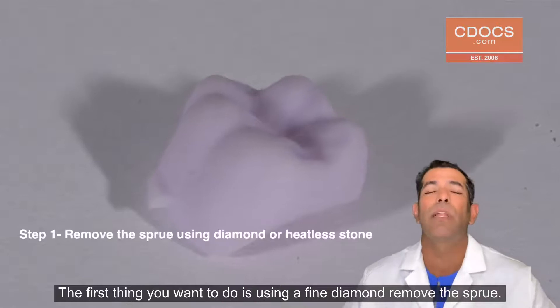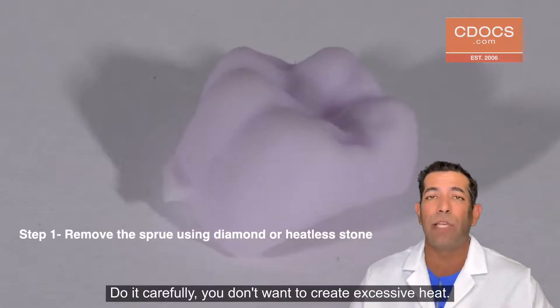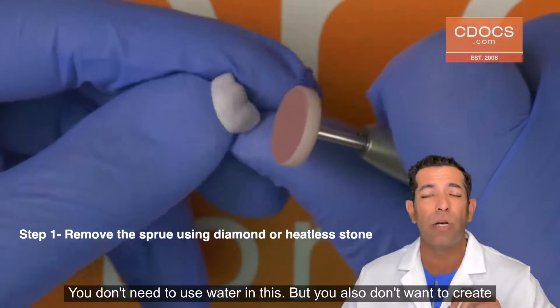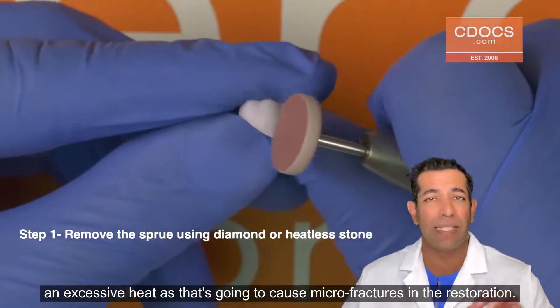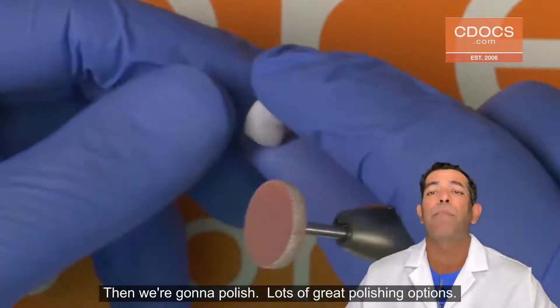So how do we do this? The first thing you want to do is using a fine diamond, remove the sprue. Do it carefully — you don't want to create excessive heat. You don't need to use water in this, but you also don't want to create excessive heat as that's going to cause microfractures in the restoration. Then we're going to polish.